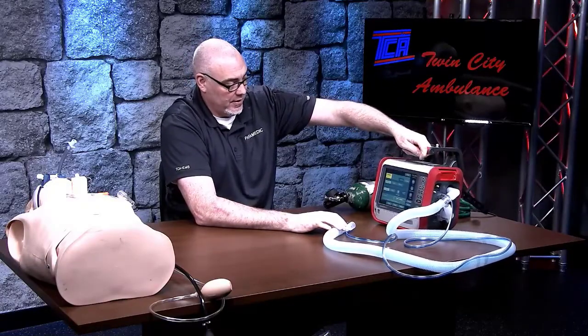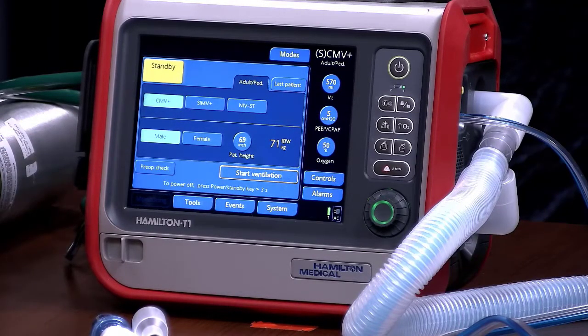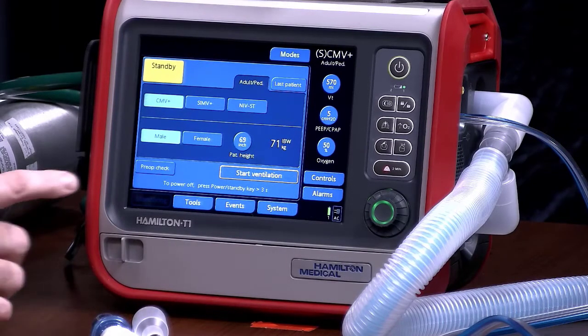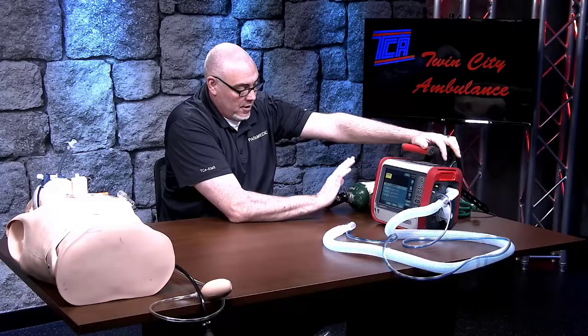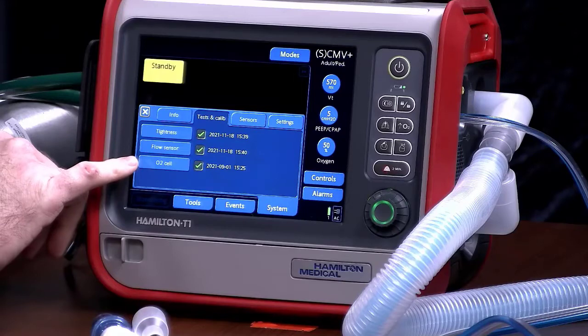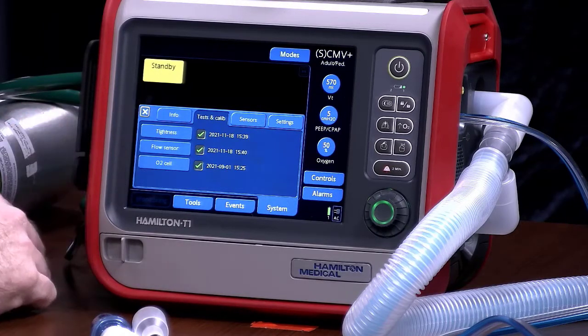Once the self-test goes through, you're going to have a pretty big screen and it looks daunting, but it's really not. We're going to go through the pre-op check right now. When you go to pre-op check, click on that button — it's going to give you three different pre-op checks to do. Do not do the O2 cell check; that is routine maintenance done by the people who service the vent, not something we're doing in the field. The only two checks we're going to do are tightness and flow sensor.